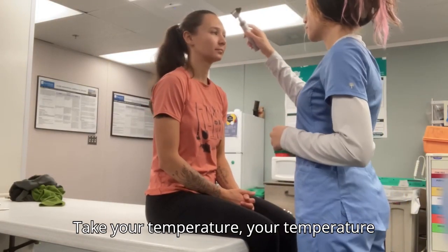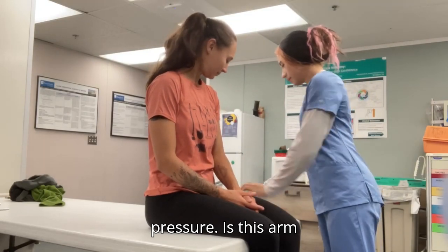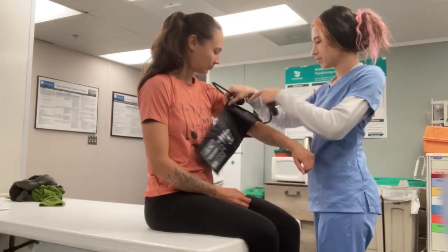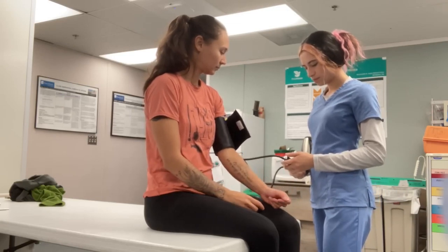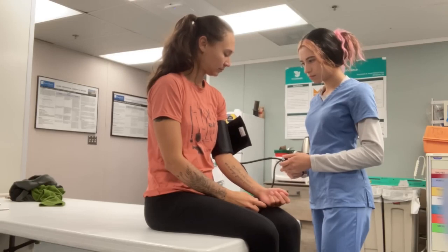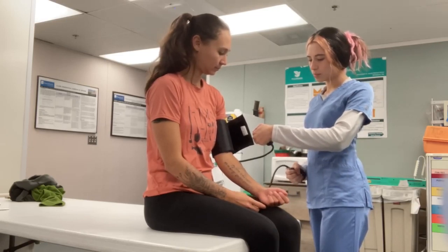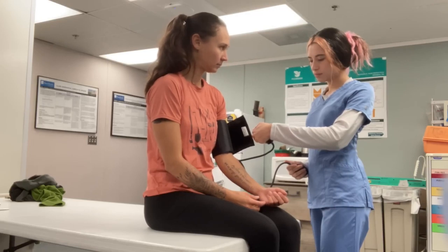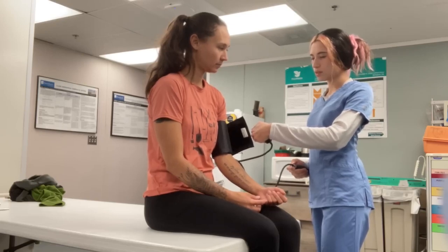Take your temperature, your temporal temperature real quick. Perfect, 98.4. Now I'm going to take your blood pressure. Okay. Is this arm okay? Yes. Okay, thank you. I lost the pulse at 110, so I'll pump up to 30 millimeters more. Okay, perfect. Blood pressure of 112 over 62.